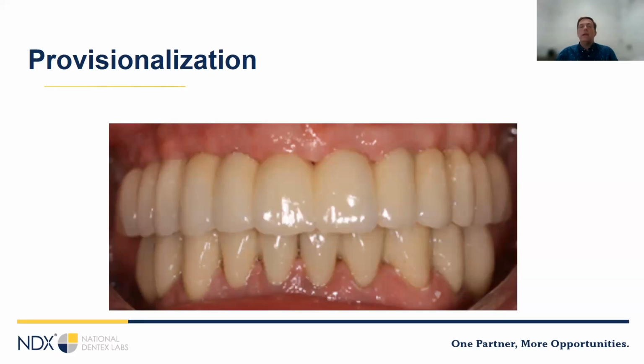If you did an immediate implant temporary that was probably matched to the patient's existing shade, and now you're going a little bit lighter, you'll probably want to have a spare temp cylinder on hand, in case you have to remake the whole provisional.